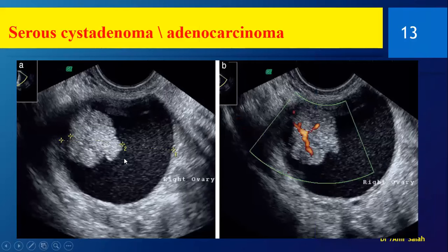Here we see a soft tissue nodule inside the lesion. We have verified it as a nodule with a cystic part and confirmed it as a tumor by vascular flow inside. We would suggest this is likely to be serous, as the soft tissue component is more evident here.